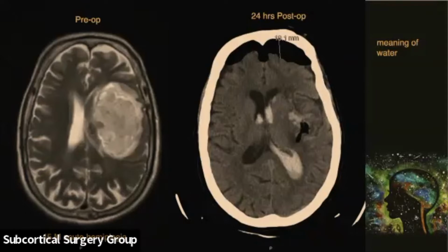You see the MRI after the expansion here. And so I wanted to take it out, both because I thought he was young and deserved the chance, but also because I wanted pathology in case there was tumor in the hemorrhage.